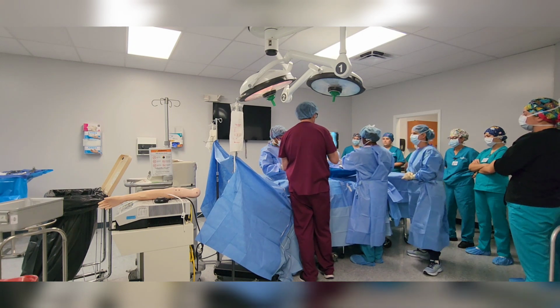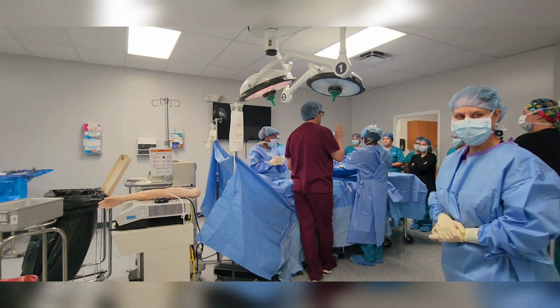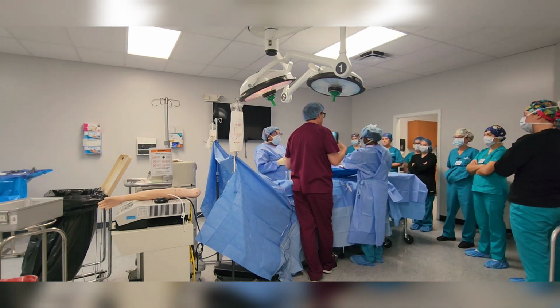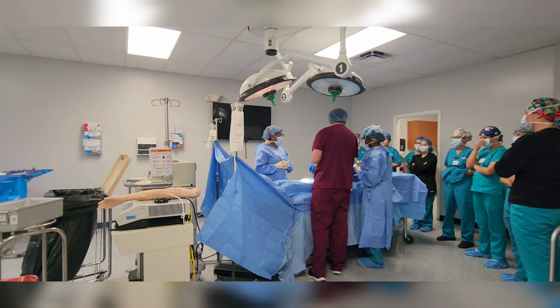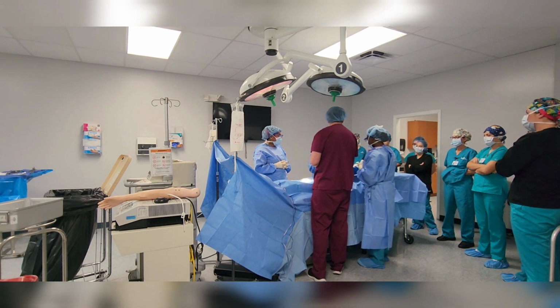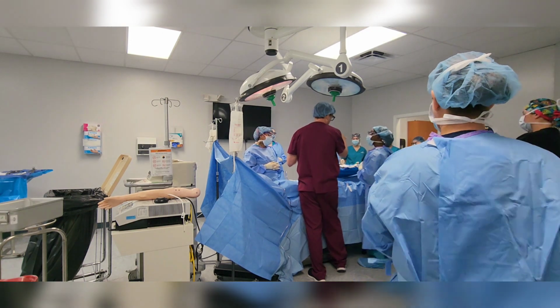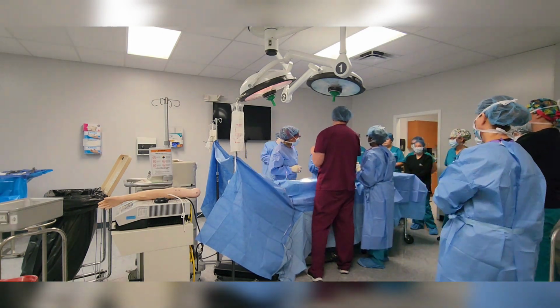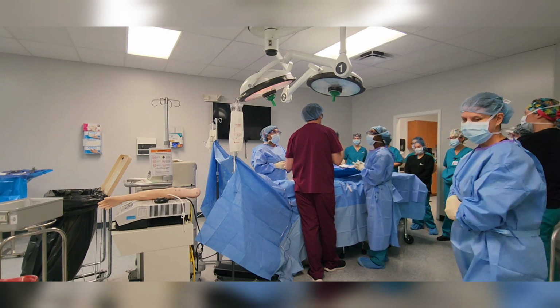So what I want you to do is, you did a great job. It's perfect. Let me just say, that's a hard approach, right? It's a lot going on. But we need to start, this is great. You had your team helping you out there. Now let's start doing a final count. And if I look back there, you think that's going to be fun to count? So as you're at externship, have an approach of organized chaos like that.